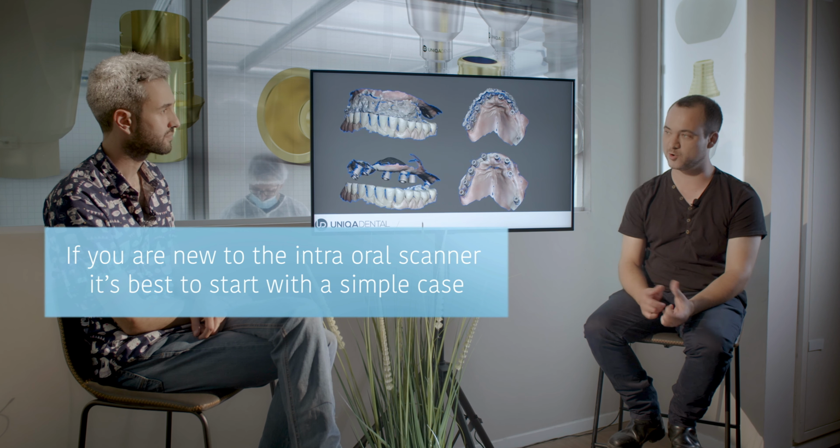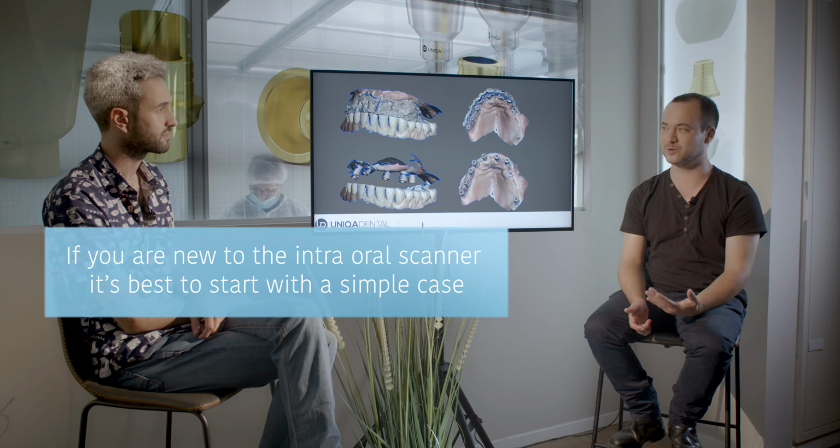So as with everything else in life, it just takes practice. You need to start small. You need to have a little bit of practice with the small works. You need to see where you have problems, and you need to know how to see those problems, because it's not visible right away. And you can scan whole jaws and everything will work when you have enough experience.